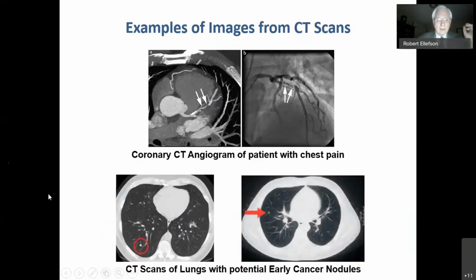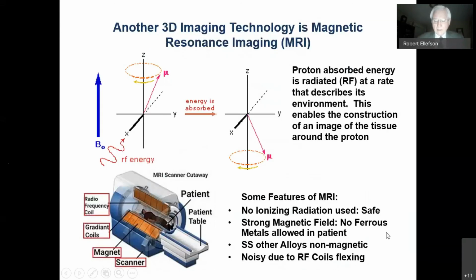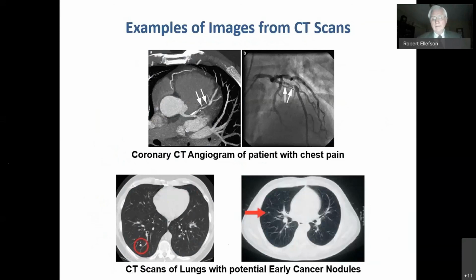This one on the left side and this one on the right side. So to the untrained eye, that might not look like that much, but the experience of the people that use these tools can get a great deal of information out of these high-resolution CT scans.